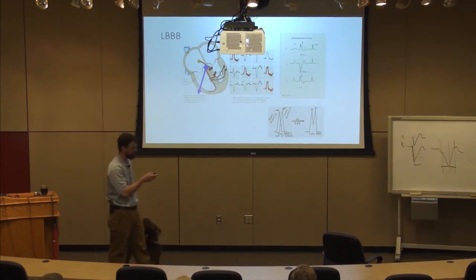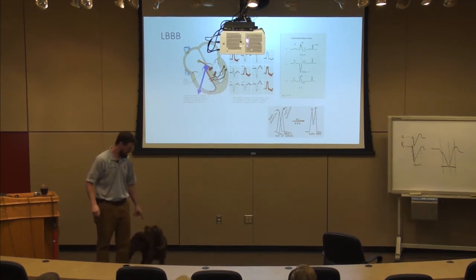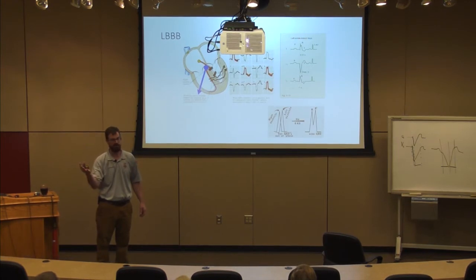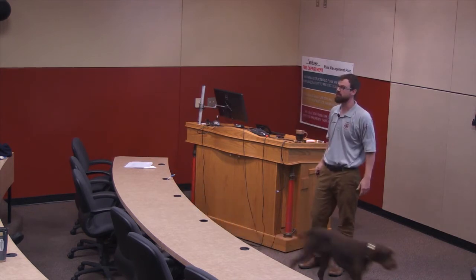Now the beauty of most EKGs is that you end up with a dominant sign and then a supporting sign on the EKG. For ST elevation MI, ST elevation is the dominant sign. My supporting sign is that I end up with reciprocal changes, right? Or if I have diffuse ST segment elevation, that makes me think pericarditis, right? If I have PR segment depression, that's my supporting part to pericarditis.